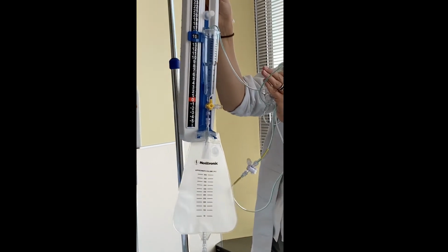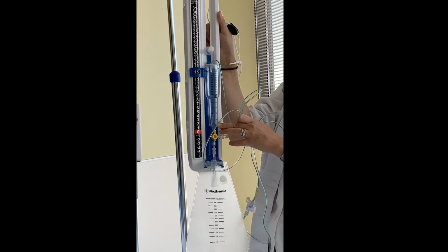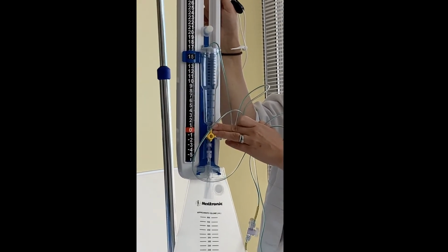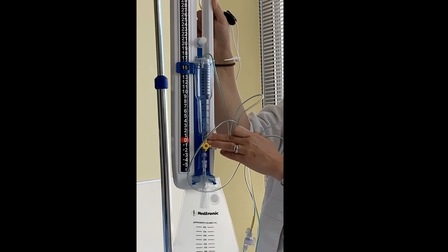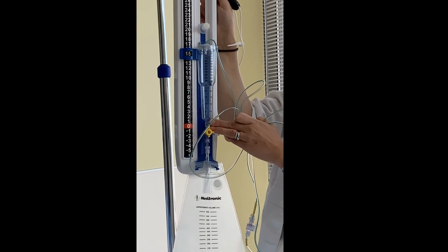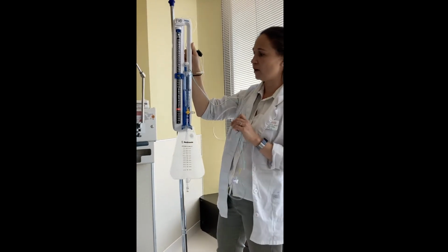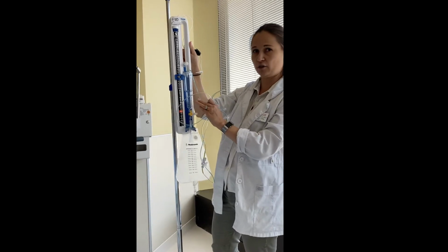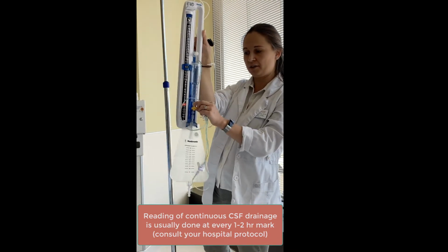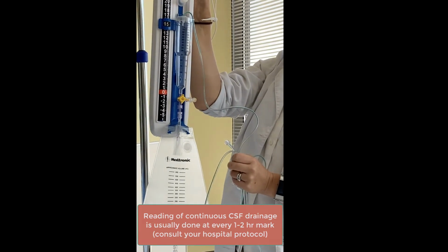This is where, if you're draining the cerebrospinal fluid, it will accumulate, and this burette allows you to measure exactly how much CSF has drained, and we usually should record this measurement every hour or 2 hours if it's being drained continuously. It could also drain intermittently, done by you, if there is a specific ICP prescribed by the surgeon. Once the burette has filled in, or once you have taken your reading at the 1 hour or 2 hour mark, you can always open the stopcock to drain the CSF that's in the burette into the collection bag.